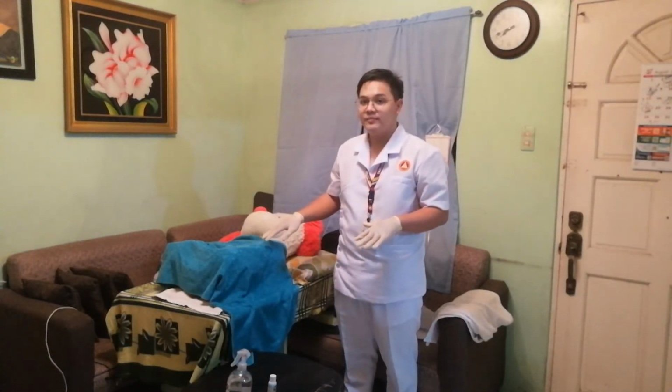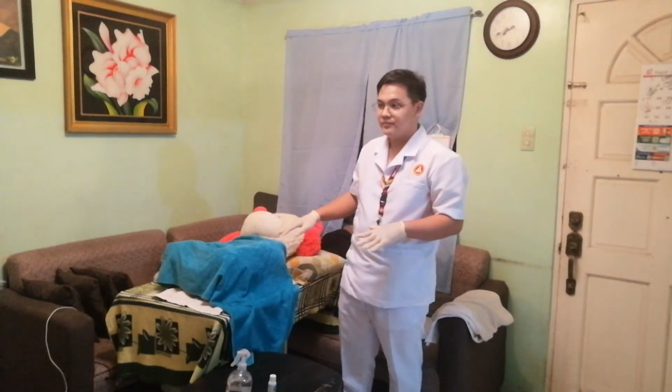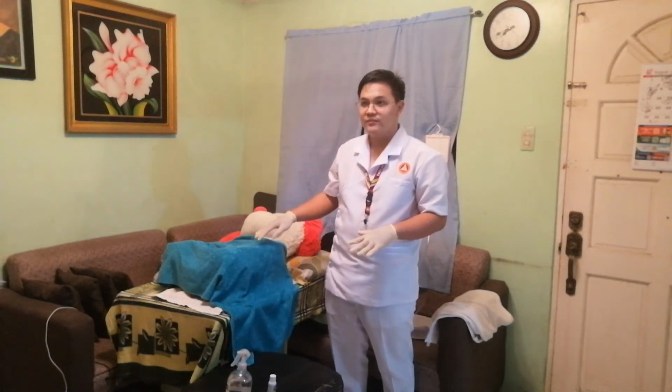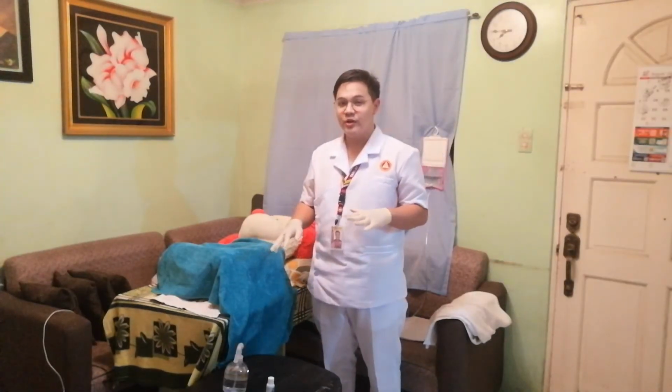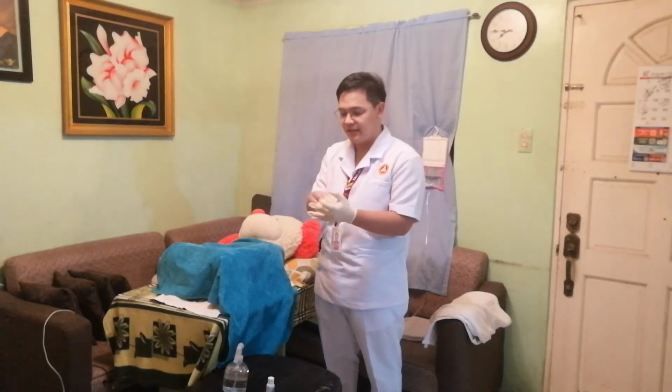And for our next step, after the client has defecated, we will now observe the feces in the toilet, the bedpan, or the commode. And if the doctor wishes a specimen or if a specimen is required, we will need to instruct our client to use the commode or the bedpan. Okay, now that we are done with our procedure, we will remove our gloves and perform hand hygiene again.